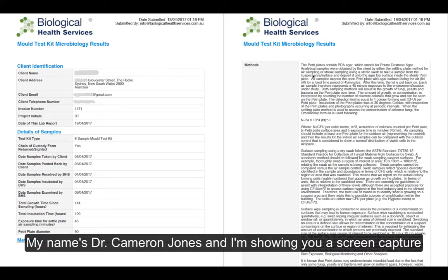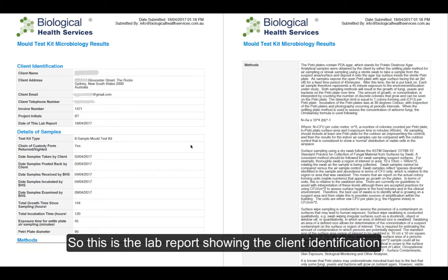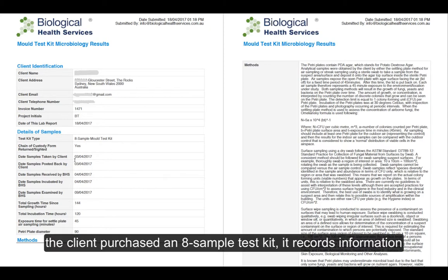My name is Dr. Cameron Jones, and I'm showing you a screen capture now of exactly what you'll get when you purchase one of our do-it-yourself mould test kits. This is the lab report showing the client identification and the details of the sample. In this case, the client purchased an eight-sample test kit.